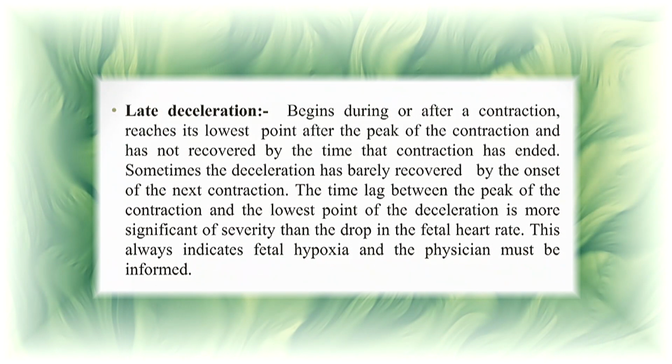Next we'll see the late deceleration, which begins during or after a contraction, reaches its lowest point after the peak of the contraction, and has not recovered by the time that contraction has ended. Sometimes the deceleration has barely recovered by the onset of the next contraction. The time lag between the peak of the contraction and the lowest point of the deceleration is more significant of severity than the drop in the fetal heart rate. This always indicates fetal hypoxia and the physician must be informed.